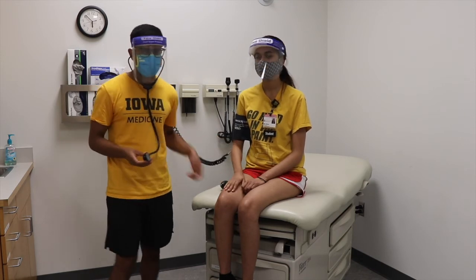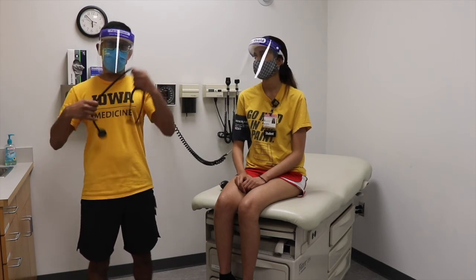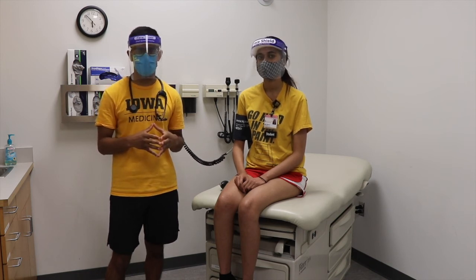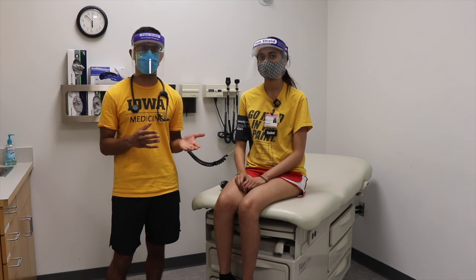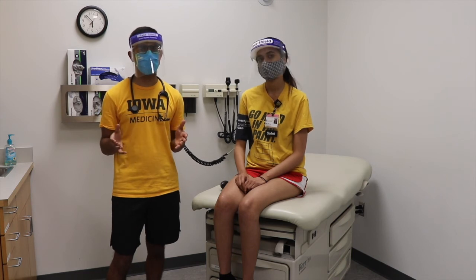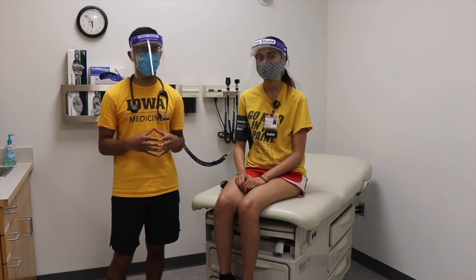All right, so I heard the point at which I started hearing the sound was 110, and so this is the systolic value, and I continued releasing air until I couldn't hear the pulse. And this is the diastolic value. So the systolic value was 110, and the diastolic value was 70. So her blood pressure will be reported as 110 over 70. And a normal blood pressure value is below a systolic of 120 and a diastolic of 80.